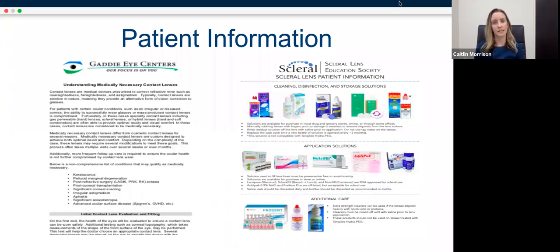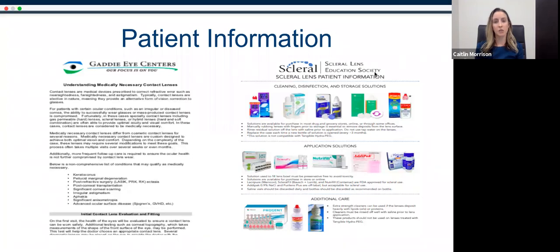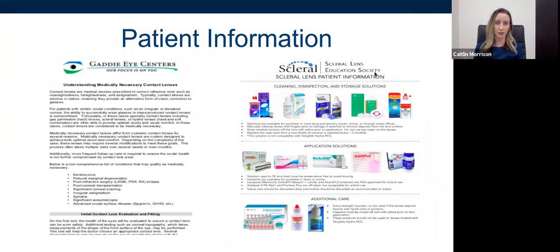That's super important. And then I did create a little handout to give to patients about everything you need for scleral lens care. So all the solutions that I want you to be using, I have everybody using ClearCare. I'm a big stickler on that. ClearCare, and then certain solutions. I use a lot of HydroPeg, so you can only have certain solutions with the HydroPeg. It's a coating on the lenses.